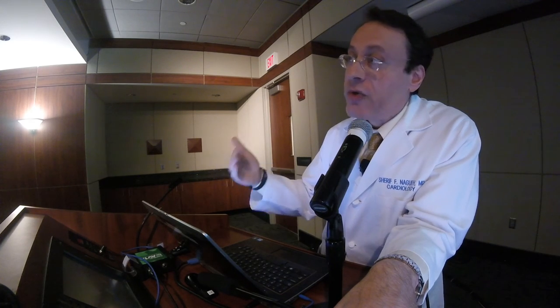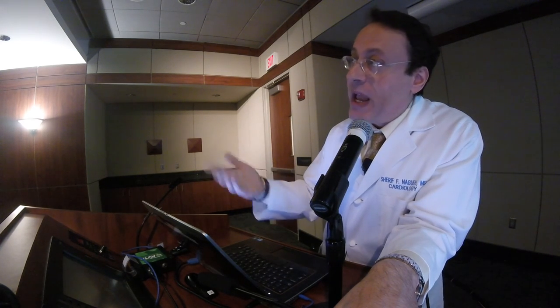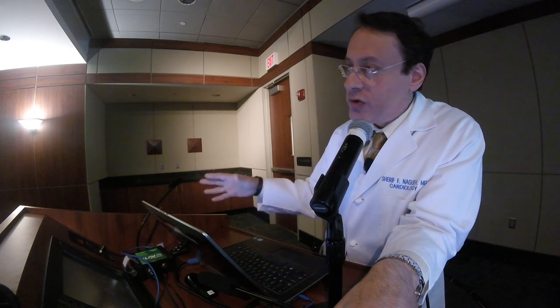And I look at the annular velocity, the E to E prime ratio. It says it is borderline. What do I do? I don't do anything. A more critical individual would look at it and say, okay, the LA is enlarged, but this is not a good quality signal. Is there something else I can look at? And now they look at the pulmonary veins and they can see additional findings to support an elevated LAP. If you just stop at these two and you do not critique them carefully, you may end up with a number of situations where you sort of move away from it.